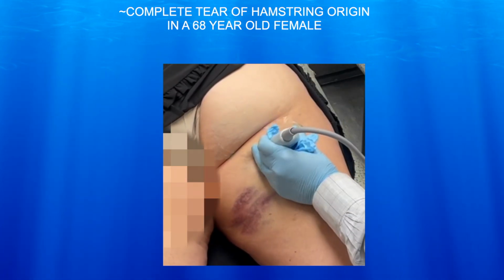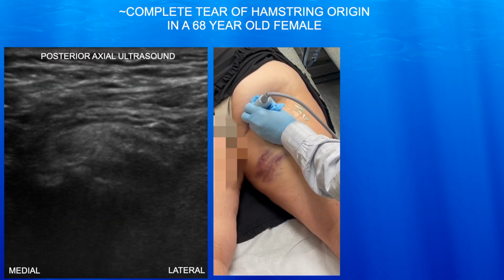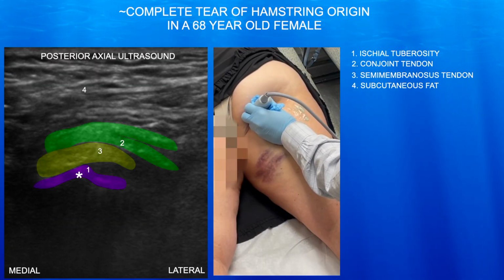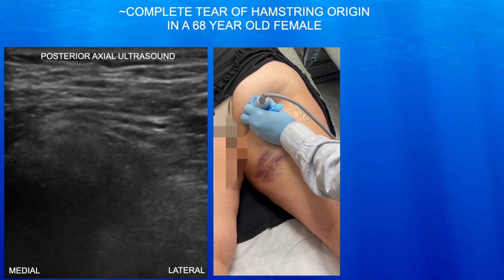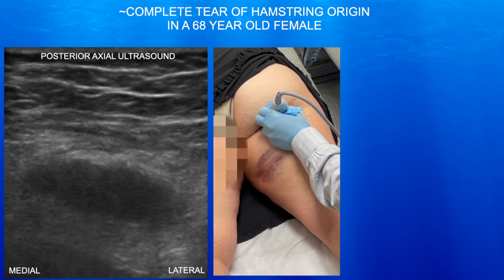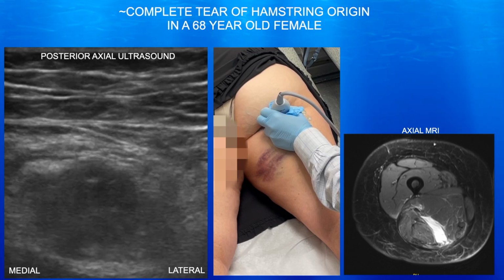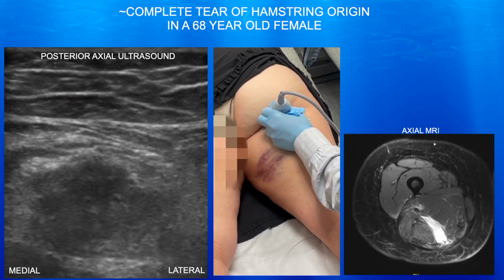Now we're going to switch orientation to an axial view of this injury. The right side of the screen is going to be lateral. Here we're looking at the ischial tuberosity again, and again it looks like there are some continuous fibers of the semimembranosus and conjoint tendons just above the ischial tuberosity. Again, we're going distally. We can appreciate this hematoma now in an axial plane. Somewhat mixed heterogeneity with some hypoechoic and some anechoic signal within this very large fluid collection.